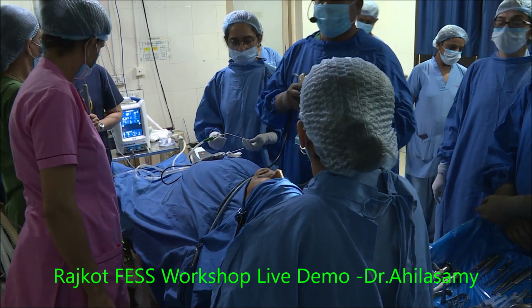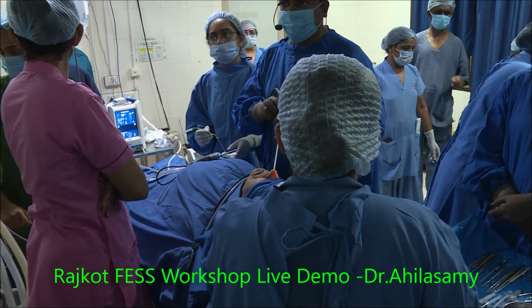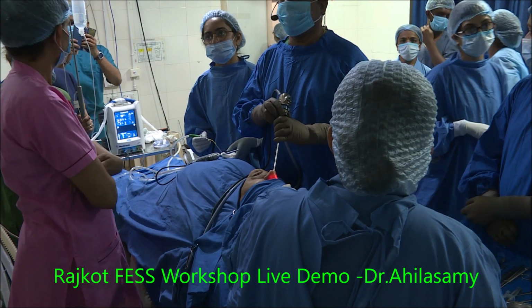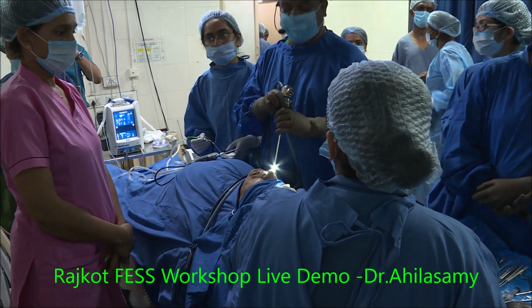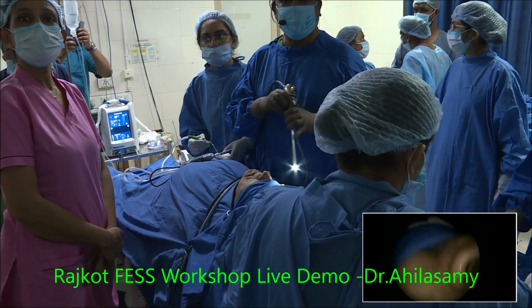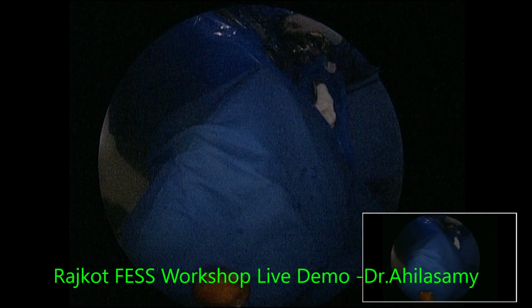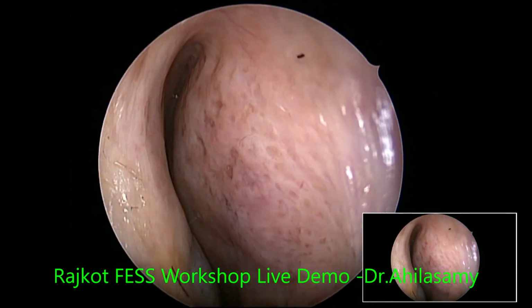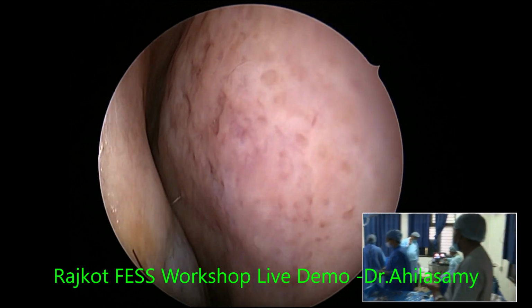Okay, that's fine. Now you see the diagnostic endoscopy picture. This is the septum on the right side. Are you getting the endoscopy picture? So this is the right nasal cavity, septum, inferior turbinate, hardly any space. So we have to do a good decongestion under local anesthesia.